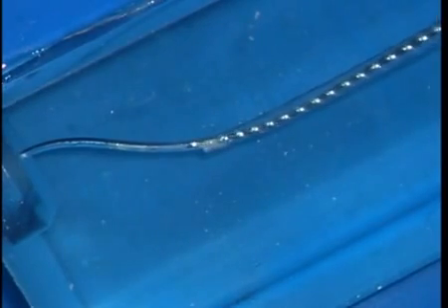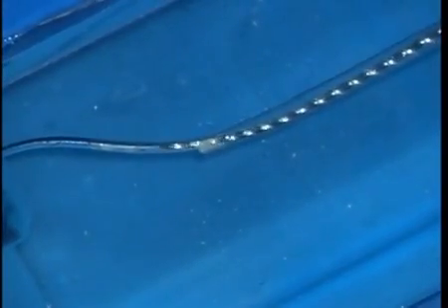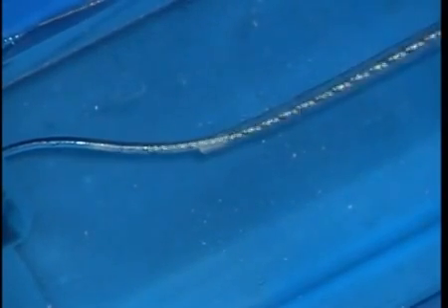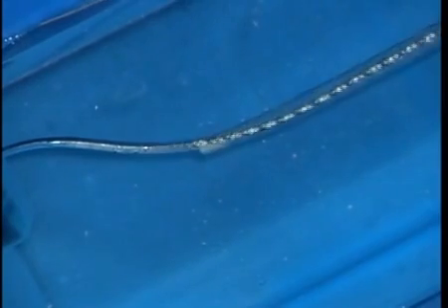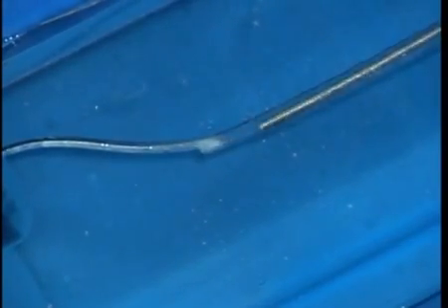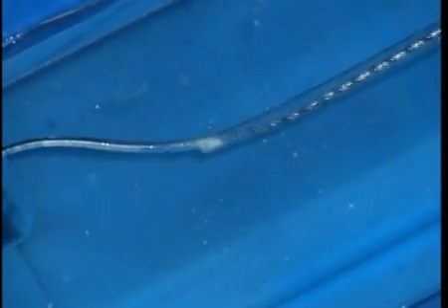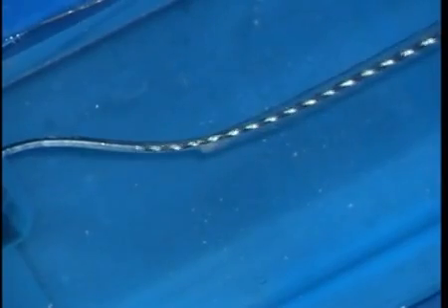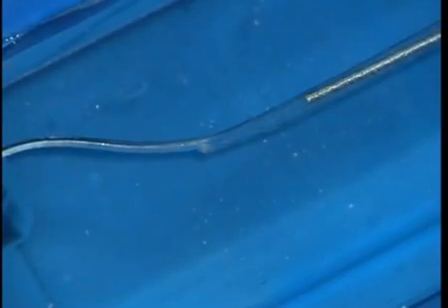It's orientated so that it moves past the ledge and a little bit deeper into the canal. I want to emphasize the importance of taking short little strokes when the file is apical to the ledge so that we can smooth and refine this region of the canal. Remember to work in a fluid-filled canal. Again, the pre-curved small hand file more predictably now bypasses the ledge, works deeper into the canal and continually refines and expands the glide path.